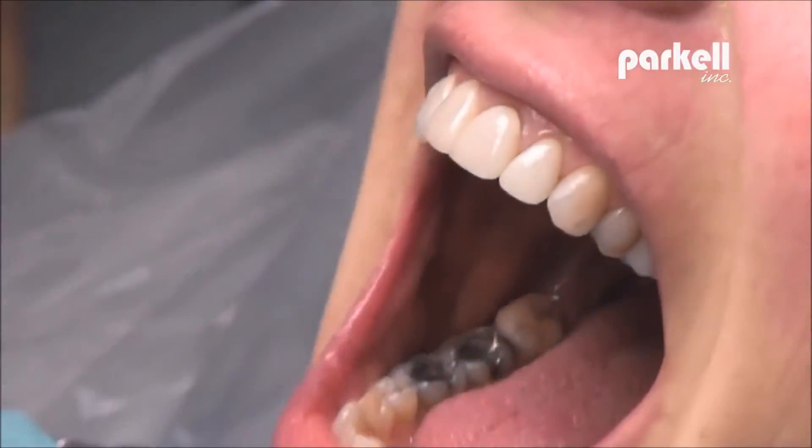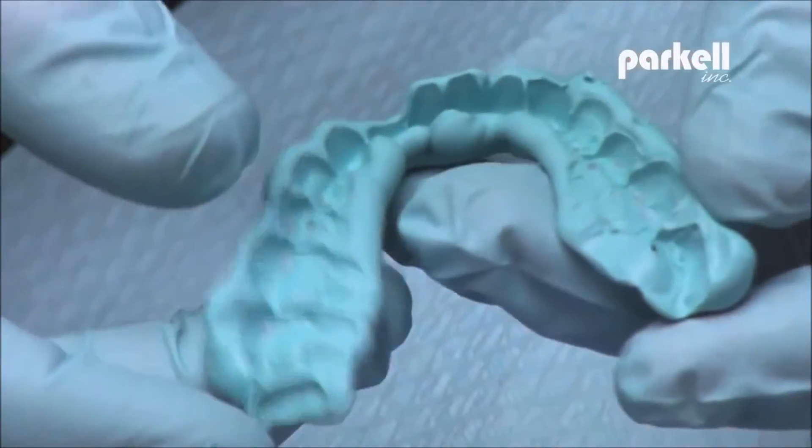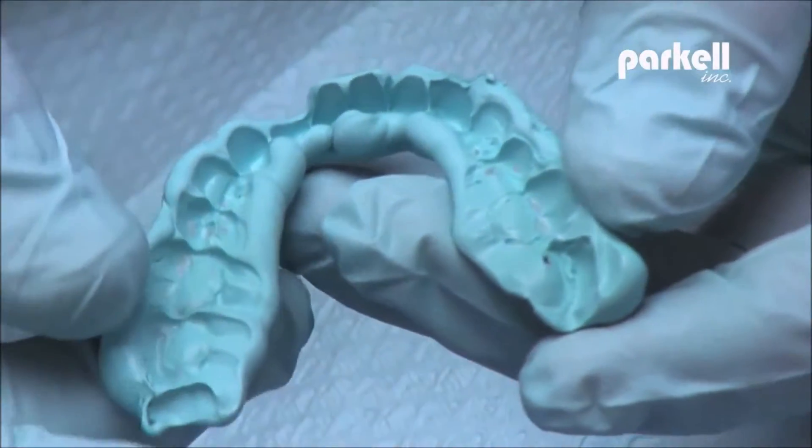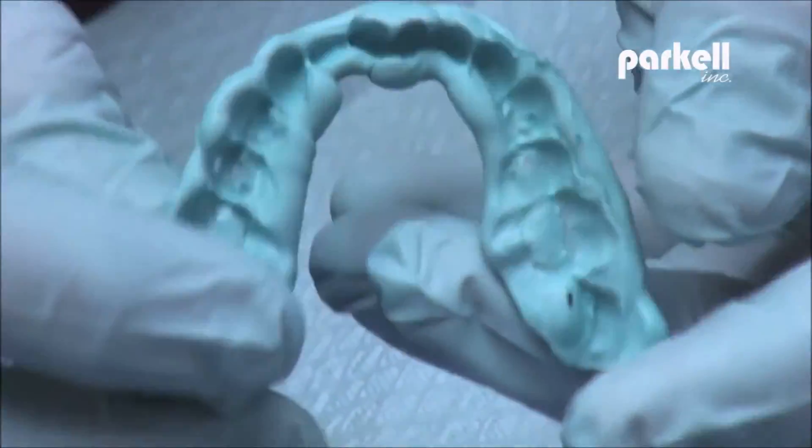There should be no Blue Moose residue left behind on teeth. Blue Moose is one of the most durable registration materials available. The registration you take today will be the same weeks or months down the road.